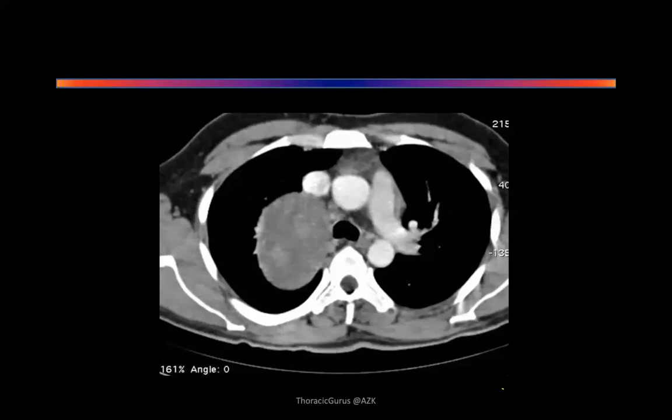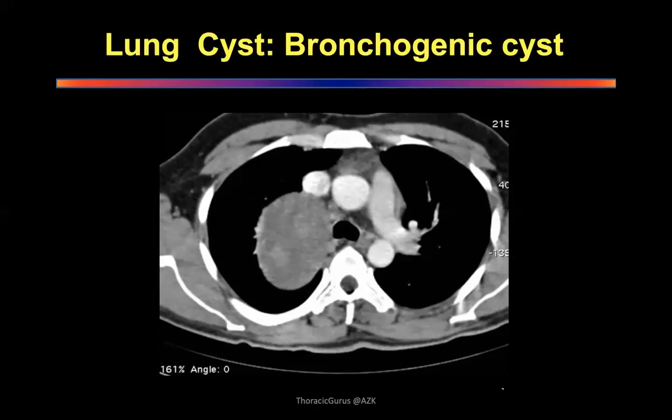But it's very easy to identify that this is a cystic lesion present in the right chest, near the right main bronchus, with no evidence of obstructive pathology within the lung. My first diagnosis probably is a bronchogenic cyst. There are a few solid areas in the cystic lesion. Maybe you're right. If you look carefully, maybe you're right. But it's very difficult to say this on a single shot. So you could say it. I will not challenge you.